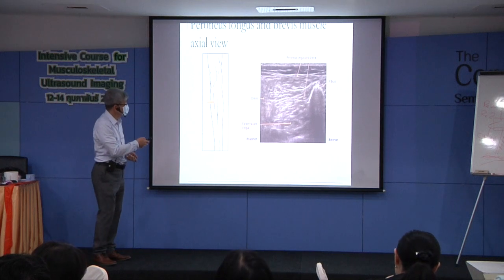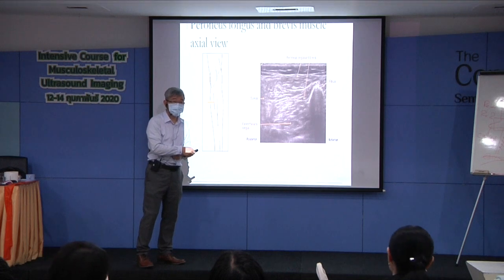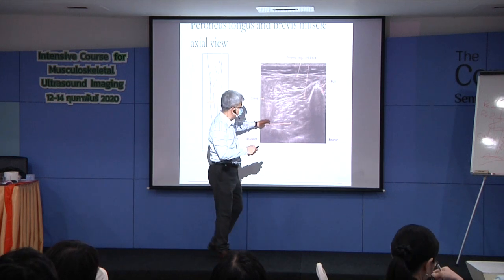Again, we are going to move to peroneal longus, but you have to practice in the lunchtime. From the top, we find the fibula first.